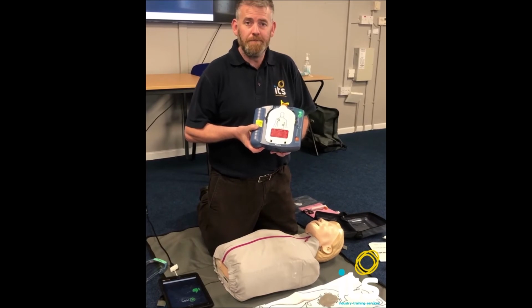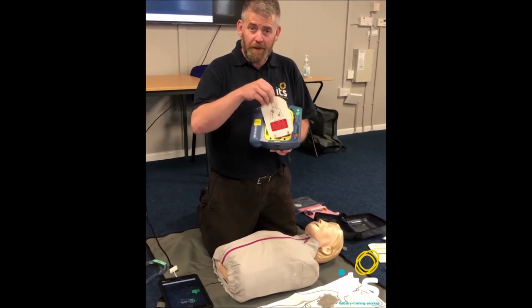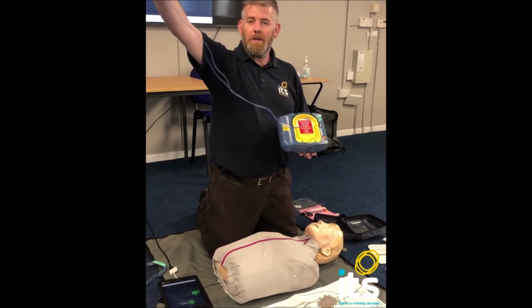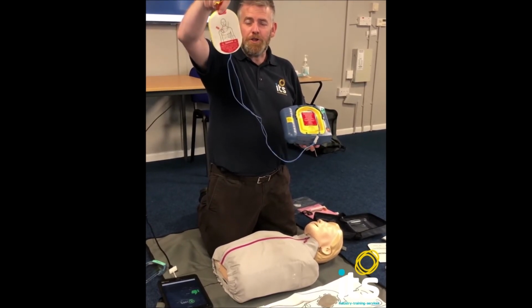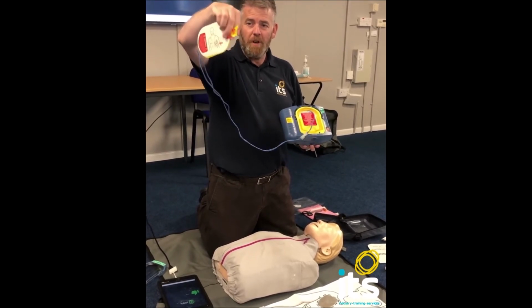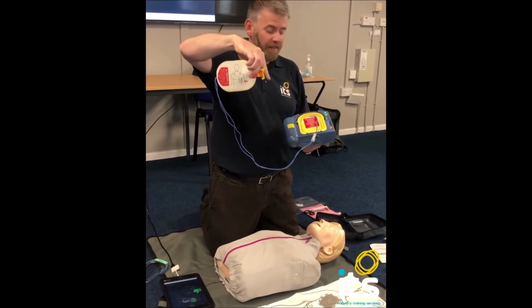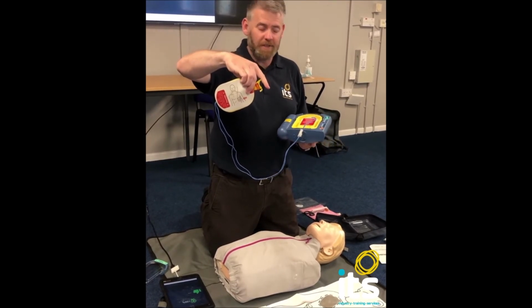Cover and take out white adhesive pads. The machine's telling me to remove the protective cover and take out the white adhesive pads, the ones with the wires attached to them. Look carefully at the pictures on the white adhesive pads. Peel one pad. There's 2 different positions for the pads to go in. It doesn't really matter what pad goes down first. It just matters you put the right pad in the right place.